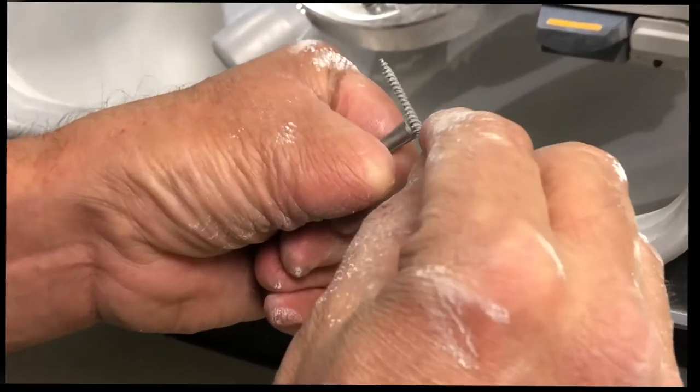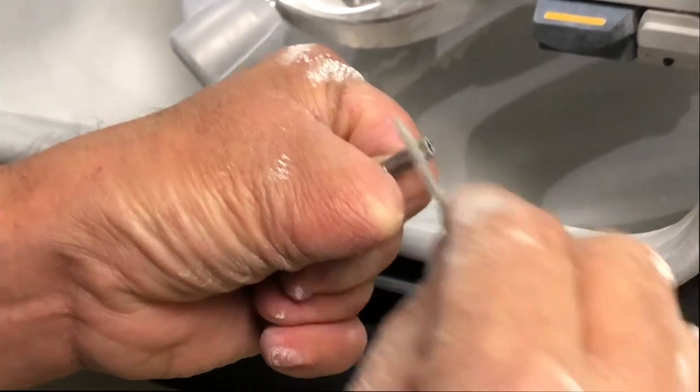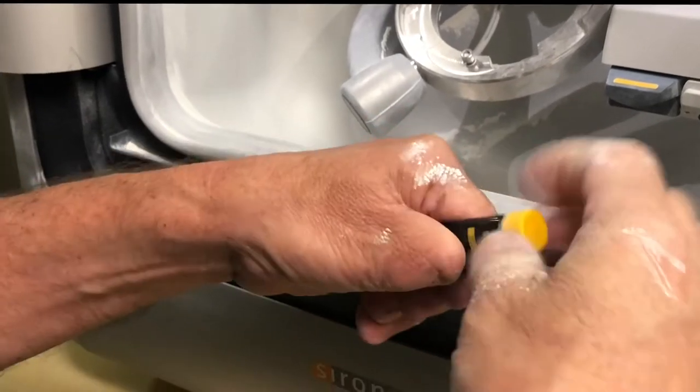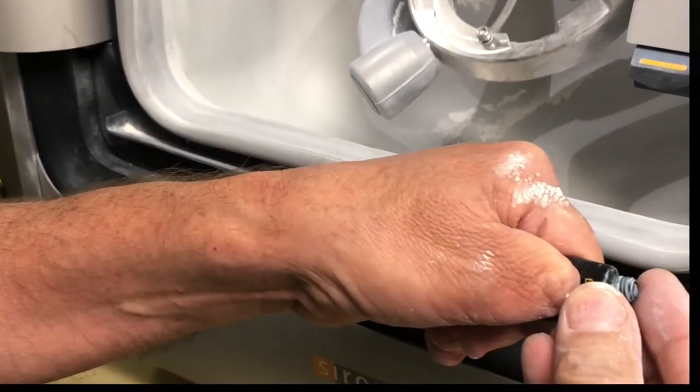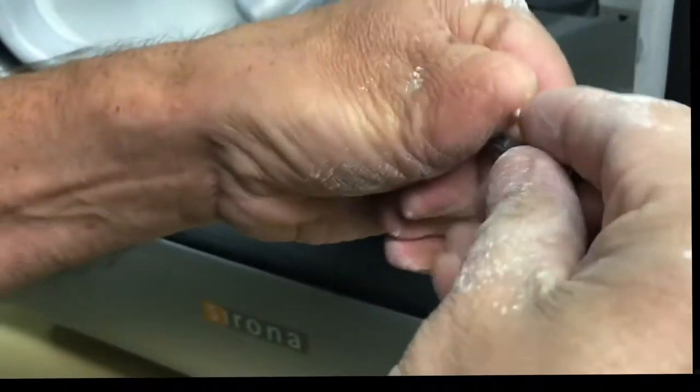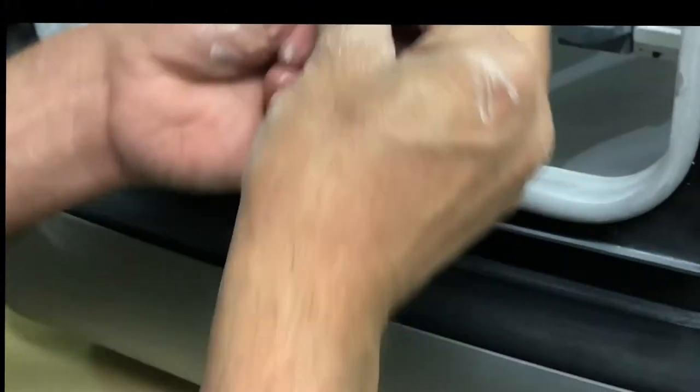Use it again to clean all of the zirconia off of the sides right in through here. Then we take a little bit of lubricant, put it on our fingers — very little — rub it together, and then you can put it on the outside spindle.